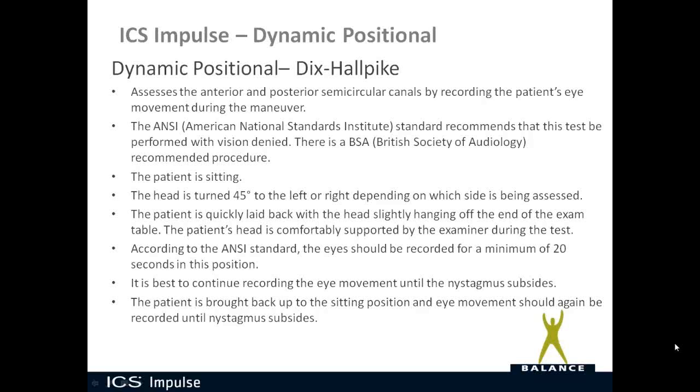The ANSI standard, or American National Standards Institute, recommends that this test be performed with vision denied. I also want to mention that the British Society of Audiology also has a recommended procedure for the Dix-Hallpike. So the patient is sitting, and as I'm talking through how the test is performed, we're going to show you a video of a patient actually being positioned into these different positional tests.